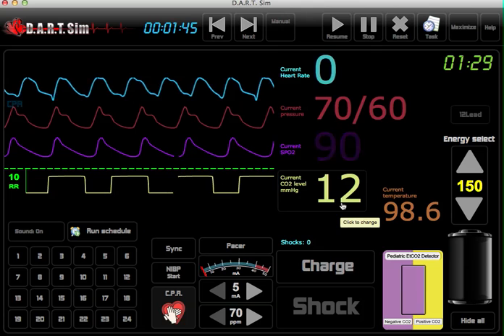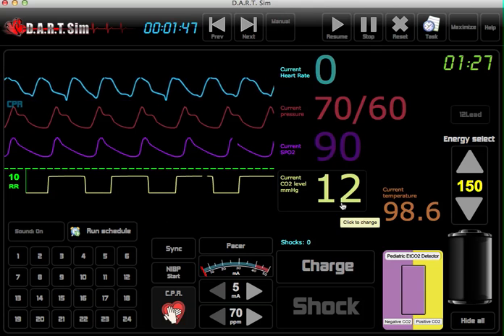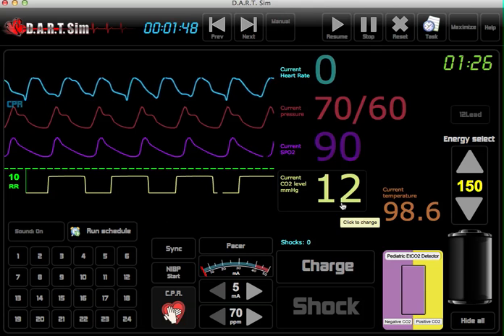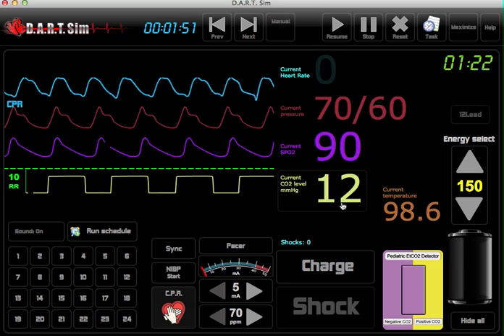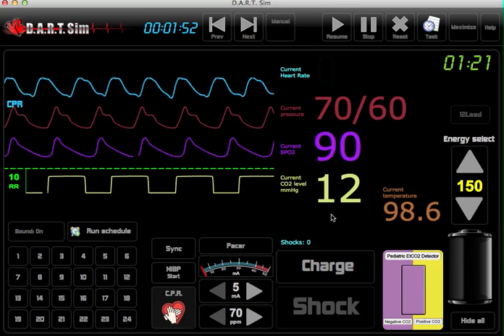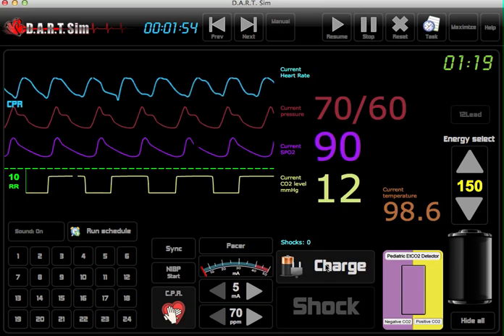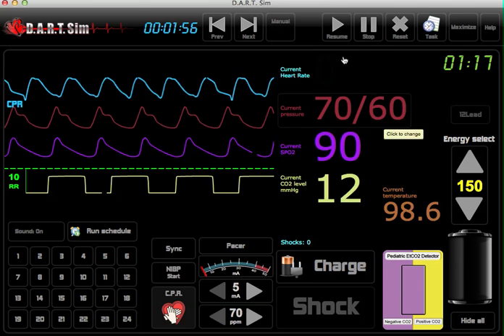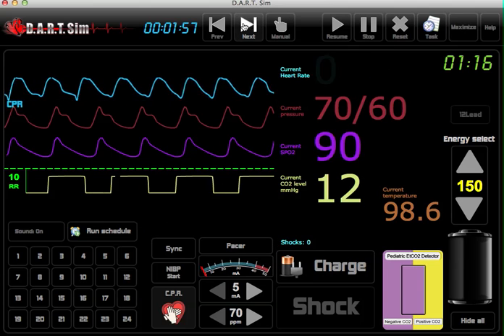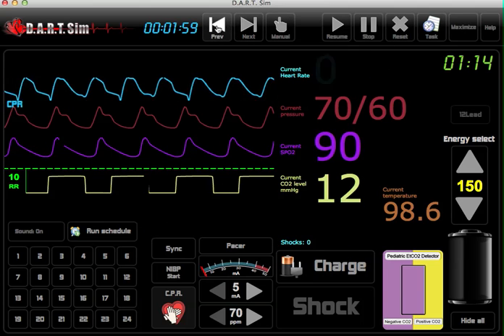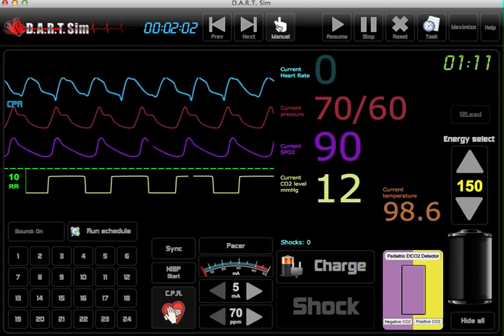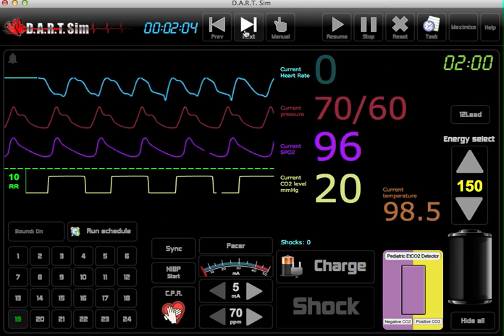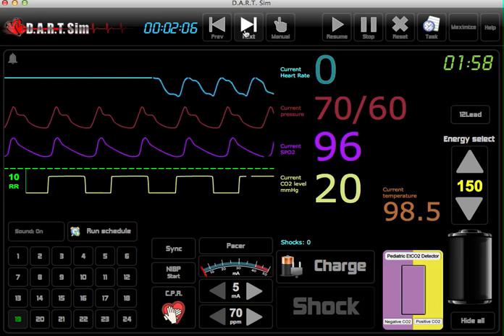You can also adjust that to simulate return of spontaneous circulation. Again, we can charge and shock. You can also reverse or go to manual mode at any time. So if we go to the next scenario, it looks like we have asystole.